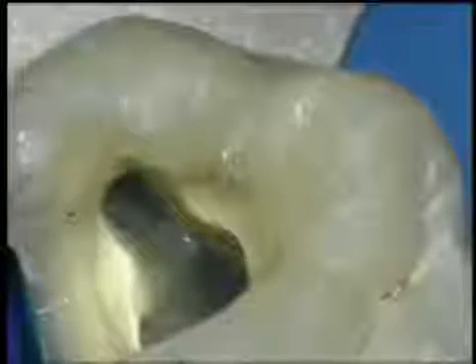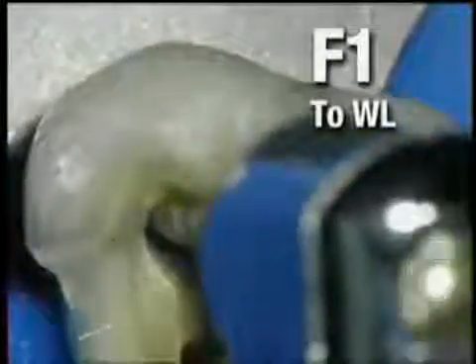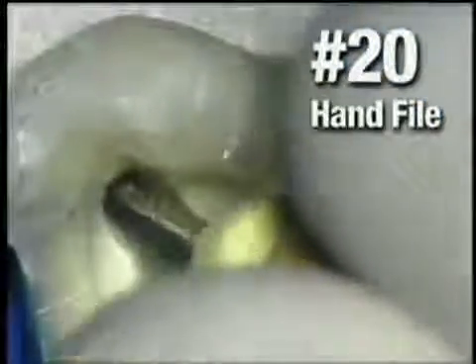Finishing the canal shape in the apical region is next. The finishing files present three options for apical size preparation. Begin with finishing file number 1, or F1 — this has a 20 tip. Carefully work it to length and remove. To determine the actual size of the apical foramen, gauge with 0.02 tapered hand files. If the 20 hand file is somewhat loose, move to the 25. If the 25 is just snug at length, use finishing file number 2 to increase the deep shape in the canal. If the 25 is loose at length, proceed to the F3 to create a fully tapered shape to the terminus.